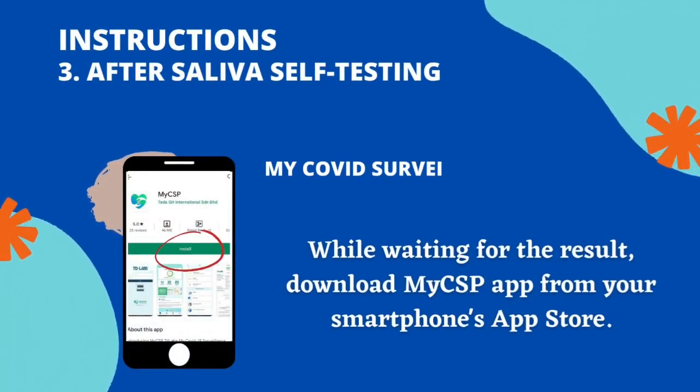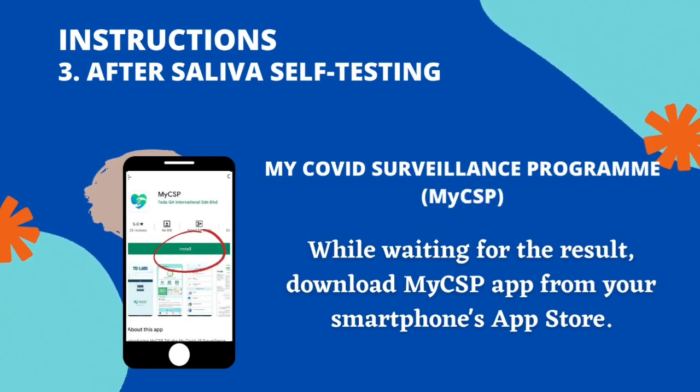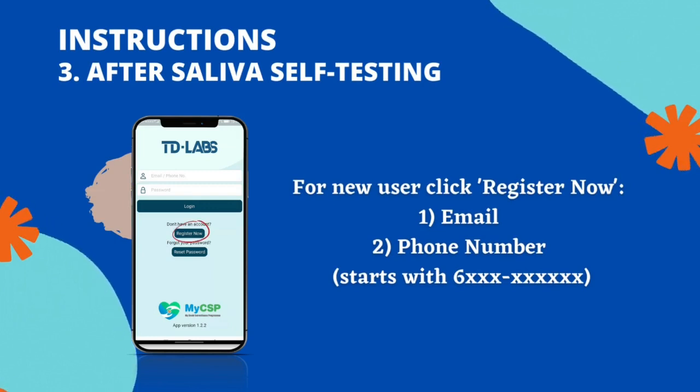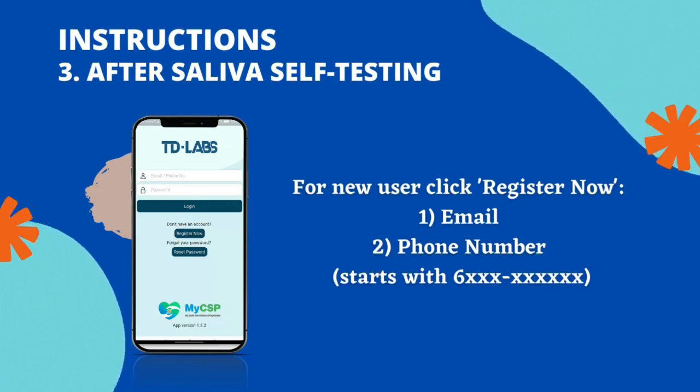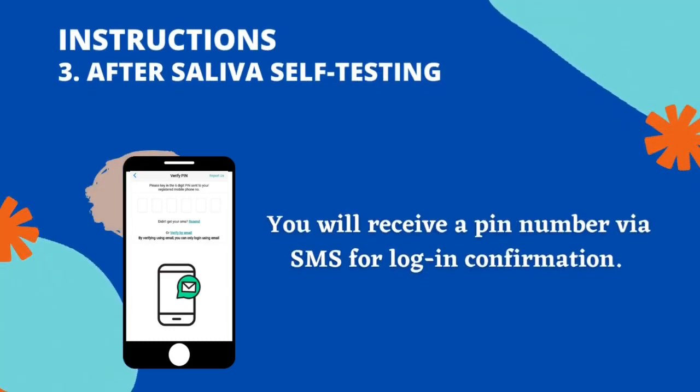While waiting for the result, download the MyCSP app from your smartphone's app store. For new users, click Register Now using your email or phone number starting with the number 6. You will receive a PIN number via SMS for login confirmation.